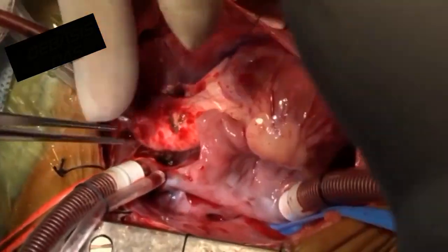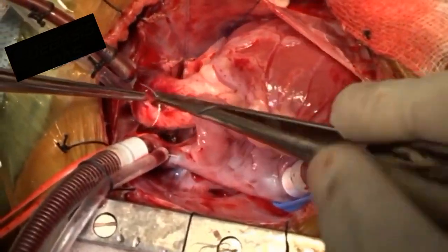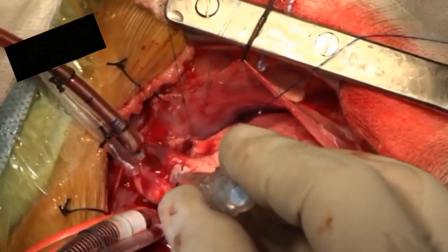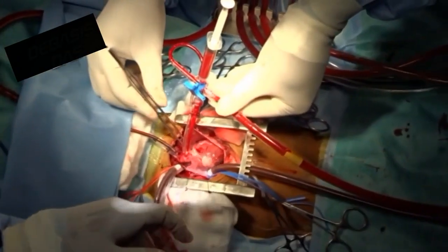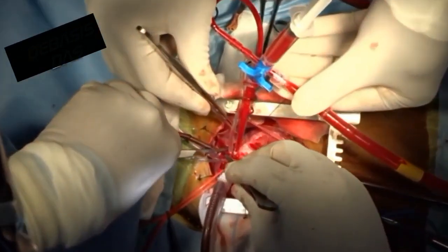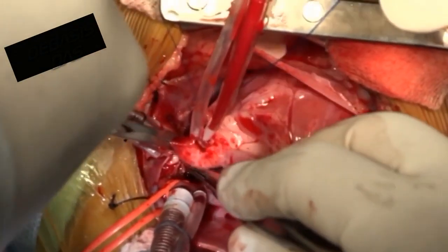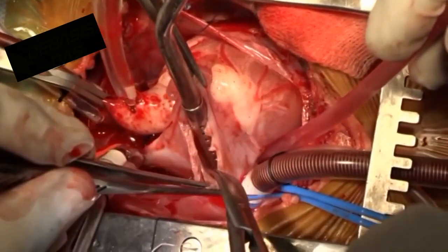Purse string suture is taken in the ascending aorta for delivery of cardioplegia. Our choice of cardioplegia is del Nido cardioplegia. The aorta is cross clamped and antegrade cardioplegia is delivered.